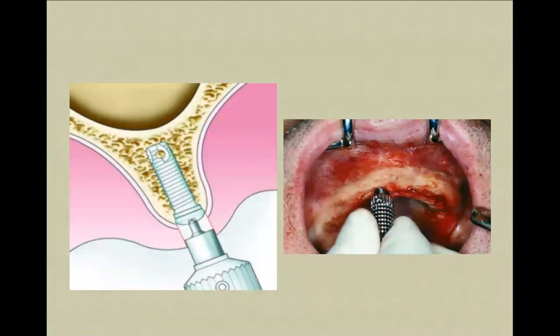you're making exposure, and here it is not necessary to expose the bone completely. You might do very, very limited exposure, as opposed to the exposure that we did for the dental implant placement, because the dental implants are there. They are integrated. And everything that will be placed further on is not titanium, it's not integrational material, it's just screws, and that's it.